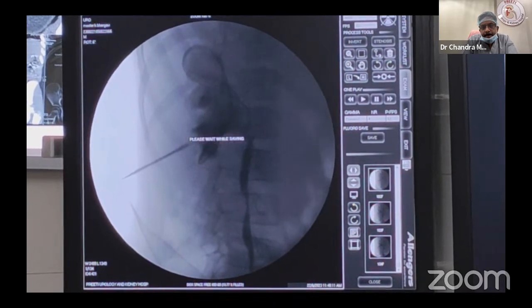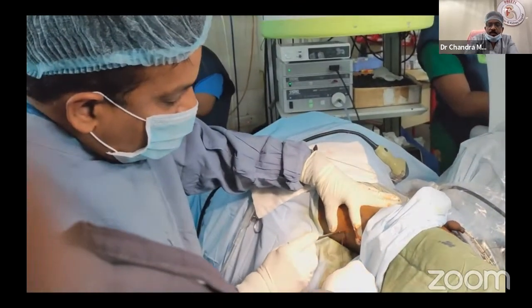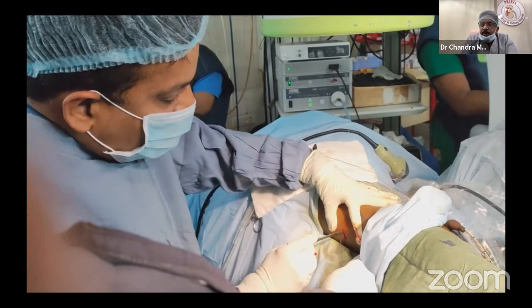The next important point is when you are doing this in children, remember, the dermis in children is very, very healthy and elastic, and it does not pierce even in laparoscopy or in PCNL. Cut the dermis clearly over the guide wire. More than the rectus sheath, the dermis will give problems and the guide wire will kink. So 0.5 millimeter, 1 millimeter, don't think about it.